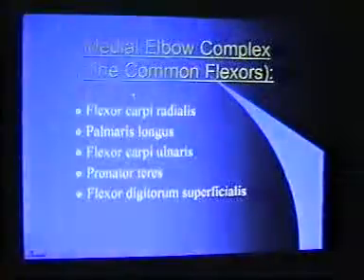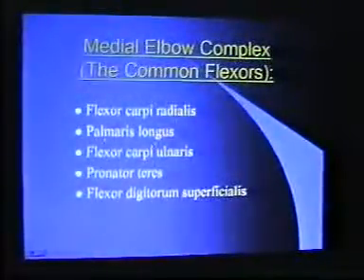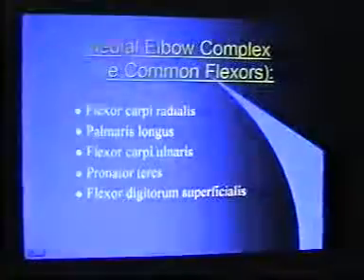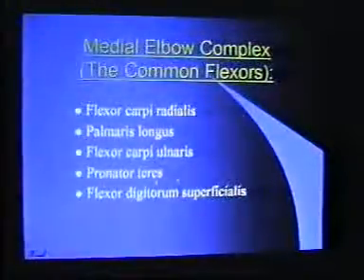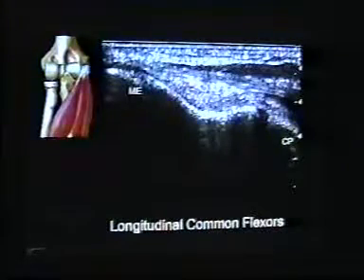Medial elbow complex. The common flexors are flexor carpi radialis, palmaris longus, flexor carpi ulnaris, pronator teres, flexor digitorum superficialis. Here is the longitudinal view of the common flexors. The muscles are here. These are the tendons. The tendons are attached here, and this is the belly of the muscles.